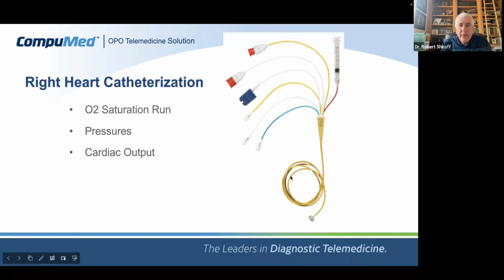This is a right heart catheter here. It was designed by two doctors at Cedars-Sinai, Dr. Ganz and Dr. Swan. I've had the privilege of working with Dr. Swan on a couple of legal cases. And it's a fascinating catheter.